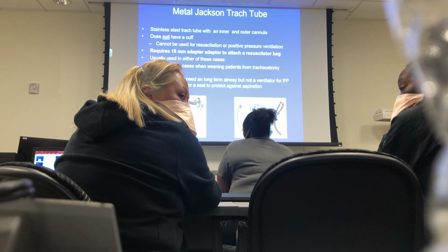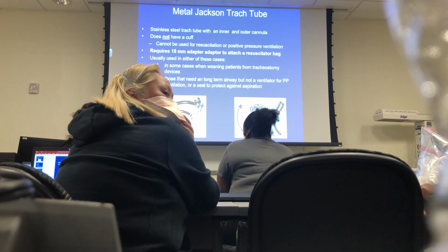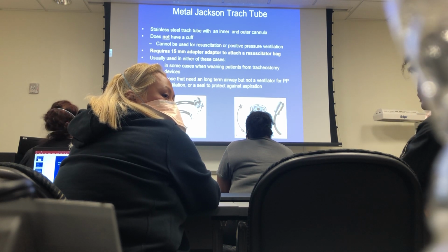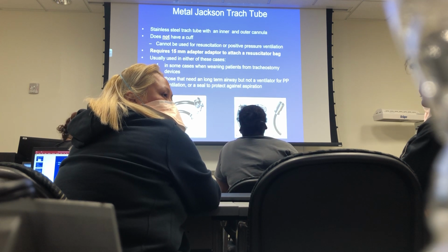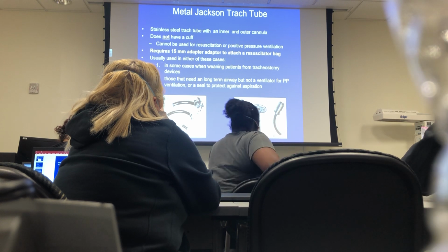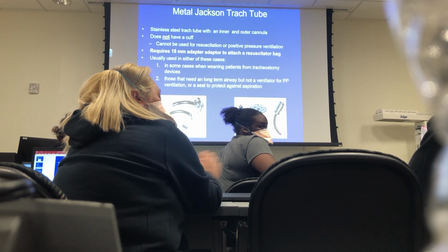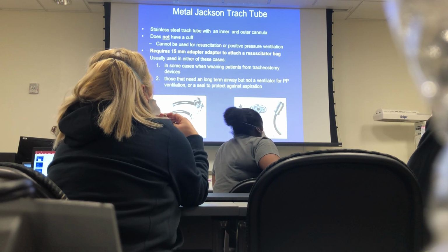So we don't need the inner cannula. Yeah, you do. I mean the other one, the bubble, the cuff. No, because these people are not on ventilators, they just need a permanent trach, okay? So these are metal trachs, they don't rust. Permanent trachs are used in people that need a permanent trach, for some reason, maybe they had cancer, okay? There's what we call laryngectomy tubes, but that's at the end of this. But you'll see some people come in with permanent metal trachs.